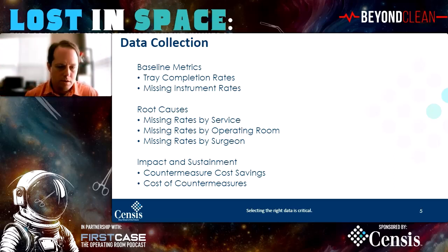Let's understand the baseline. In our tracking systems today, we already have that information. Most modern tracking systems have reporting components that let you view and export this information to tools like Excel, or pull it into common analytics tools like Tableau or Power BI. Those are widely available, fantastic analytics solutions today. Or you can just pull the data into Excel and chart it manually. Most tracking systems also have some ability to do this.